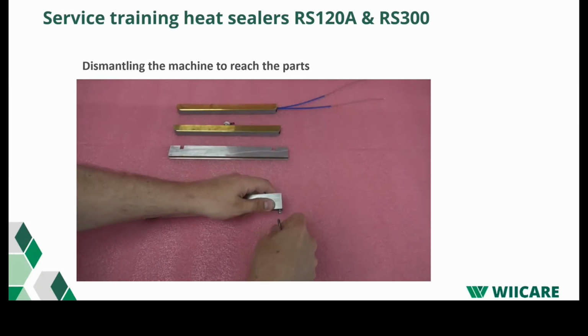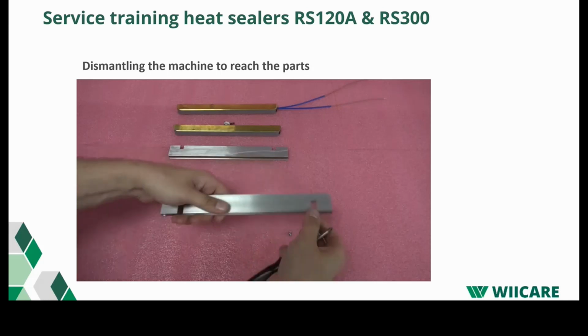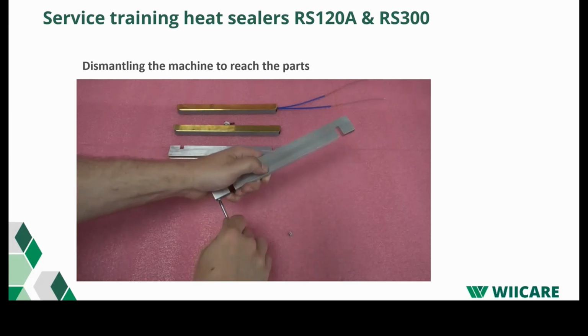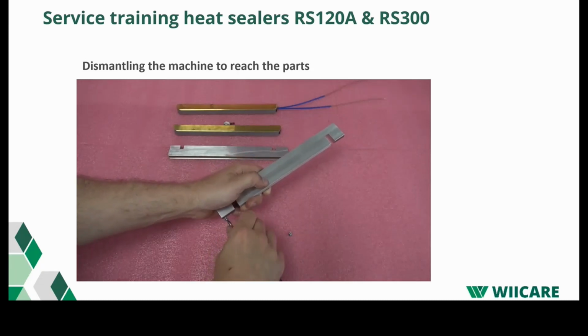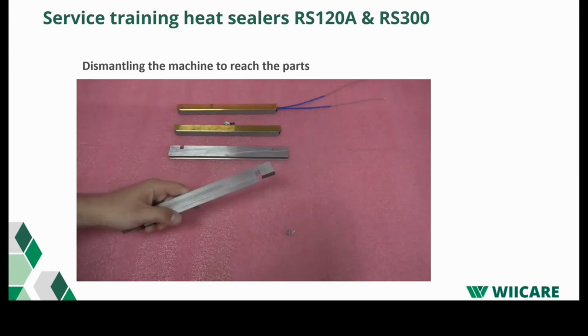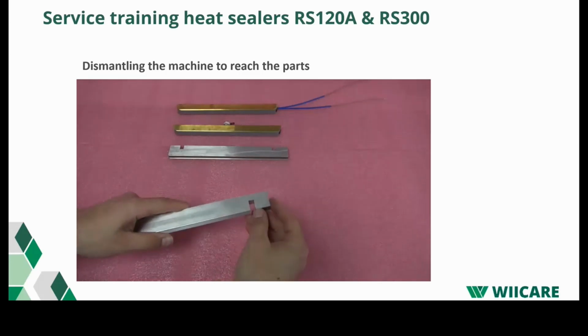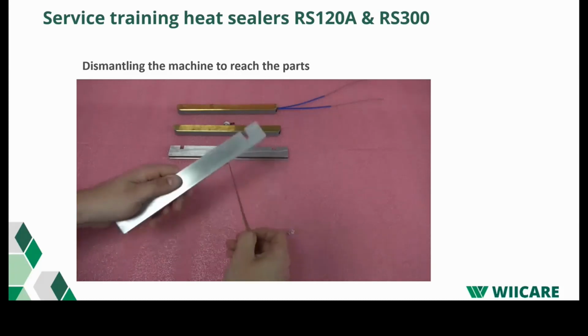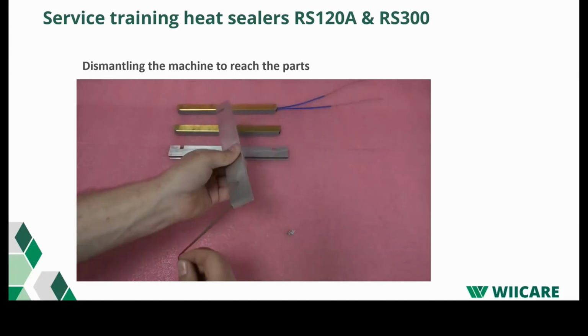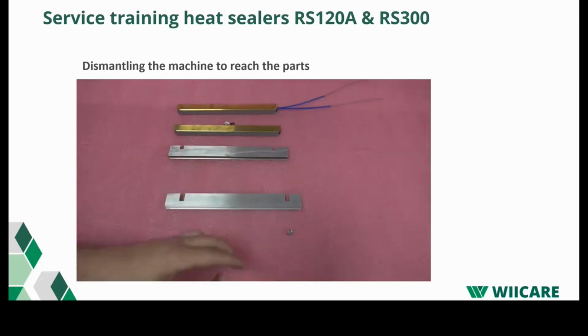And what you will see with the Teflon on the aluminium bars, you would normally see that they get damaged just by the belt rubbing over it all the time. With the heating elements, you could even see that they become a bit wide. And yeah, that's the time to change them as well, and they become porous. It is very important that you clean the surface with a degreaser.